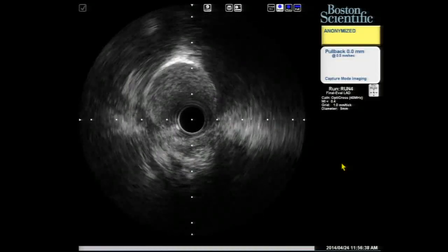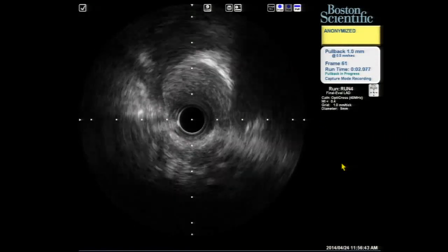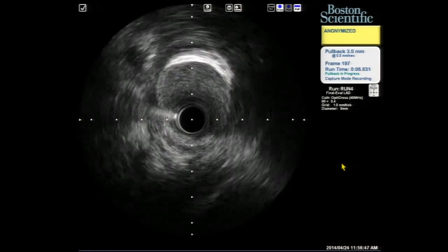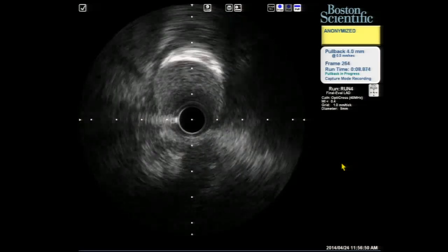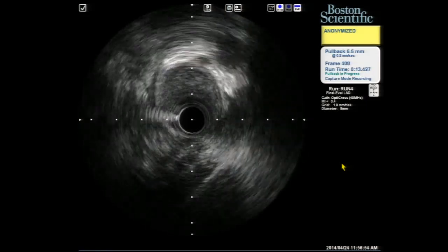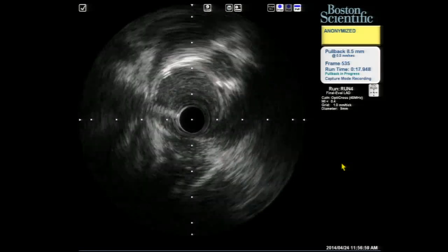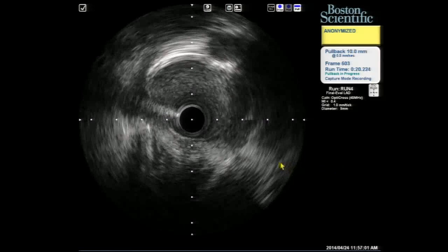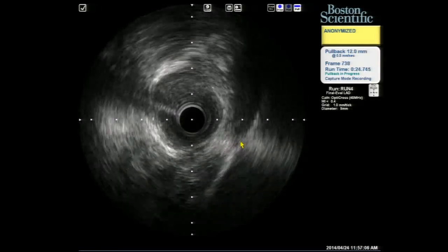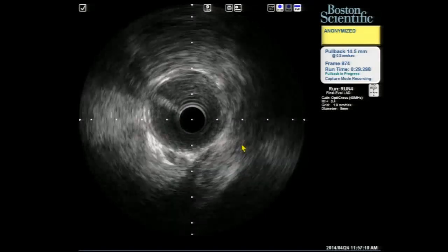Yeah, of course. I think this is an interesting discussion. It's a relatively young patient, and did by 2 tests have significant inferior ischemia. But that's a Talmudic discussion. I think you're going to have a hard time opening that antegrade. I think that the entry point was ambiguous, and it was a fair distance. But the ischemia may abate somewhat now, because part of it was the donor artery was really compromised. No question that you may get less ischemia, and you can't make an asymptomatic patient less symptomatic.